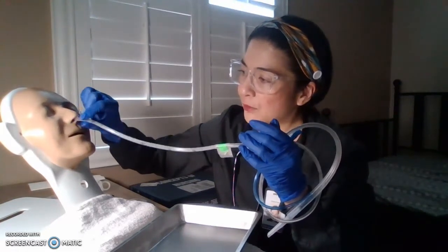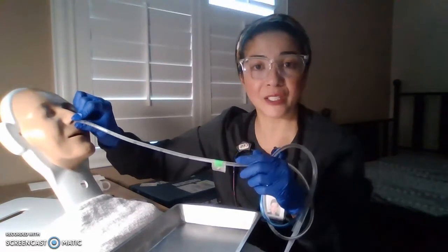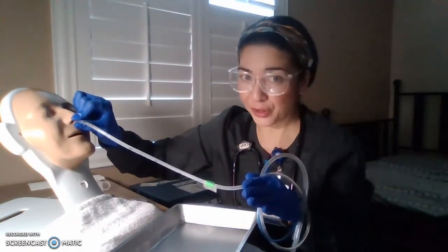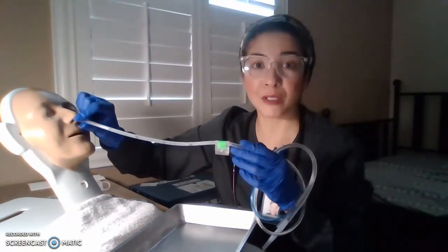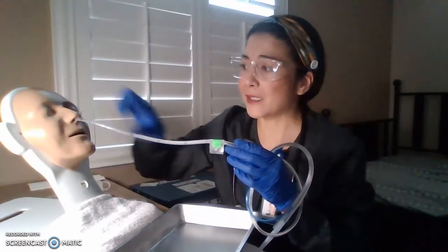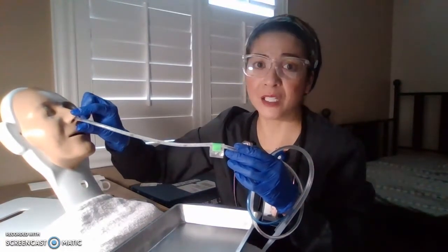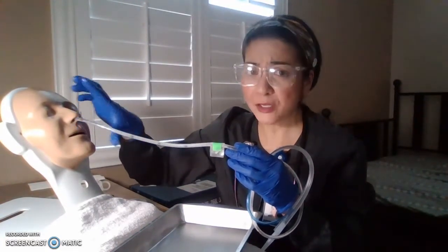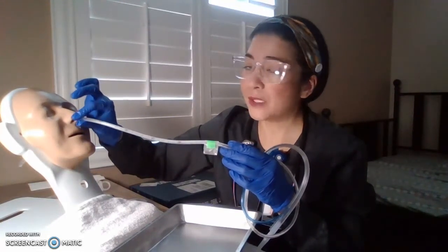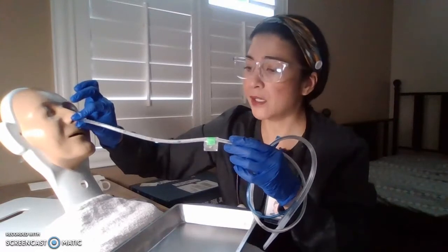So once you reach the nasopharynx, you would know because the patient will start gagging at this point. Okay, excessive gagging is not good. That means you may be somewhere else, all right? Or maybe past that nasopharynx already or in the lungs, all right? So withdraw and stop. All right.